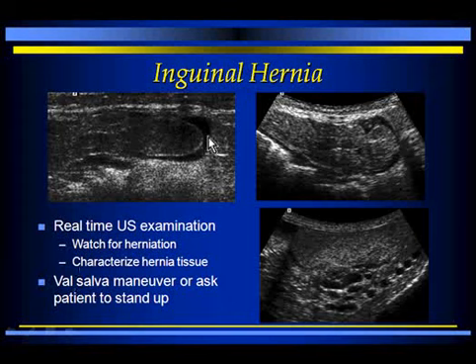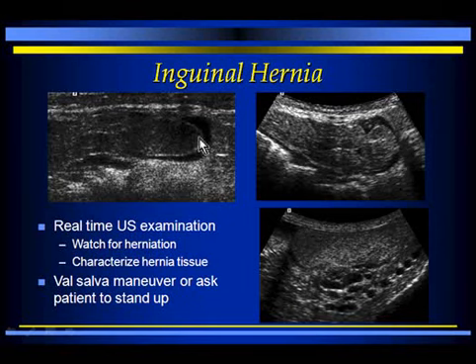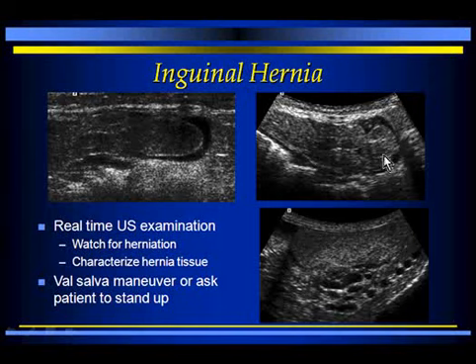So here we see a small amount of fluid, and we see this is mesenteric fat herniating down. Once again, this is a piece of omentum herniating down into the inguinal ligament.